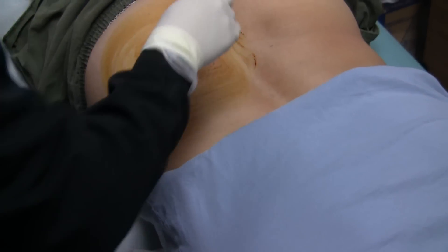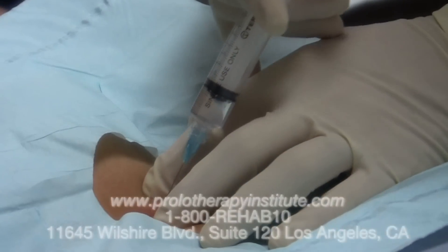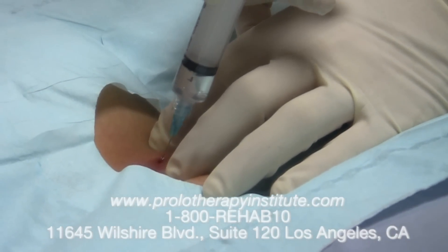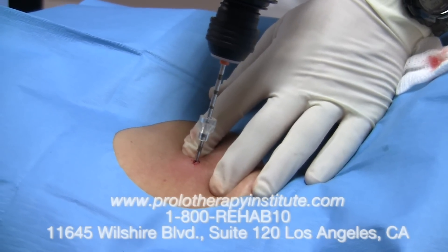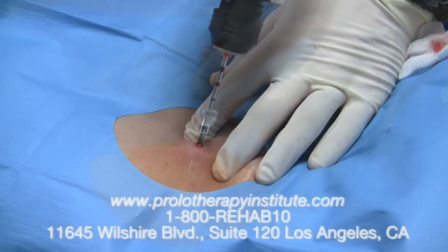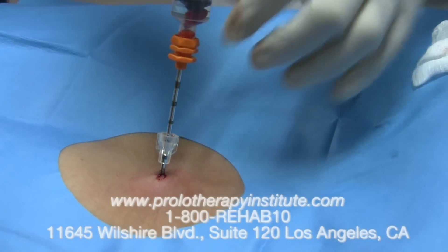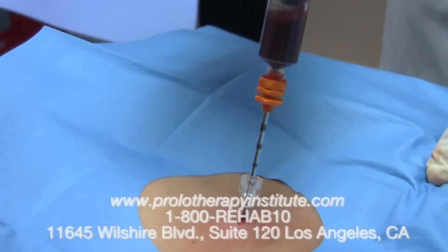First, we clean the area with surgical soaps. Then we inject with a local anesthetic to numb the area. Then we place the drill and the drill needle and we can pierce the bone very simply, as you can see. Once the needle is placed, we can aspirate the bone marrow and obtain the stem cells that we need for this procedure.